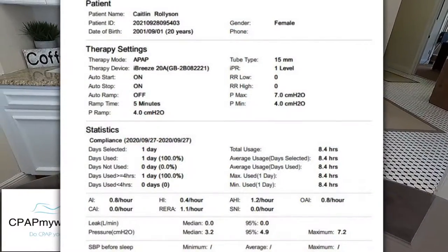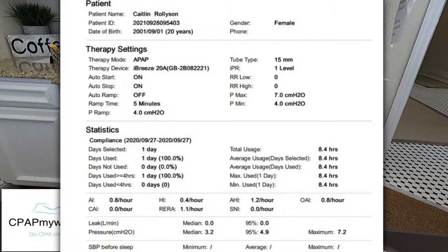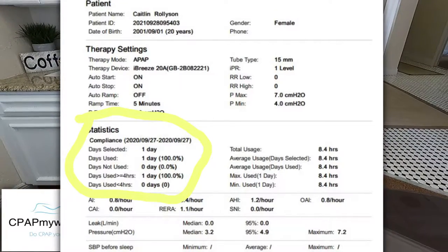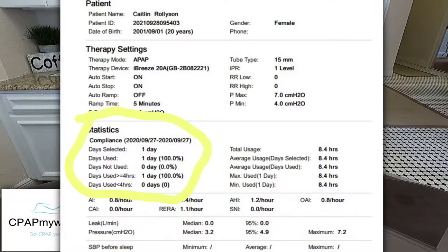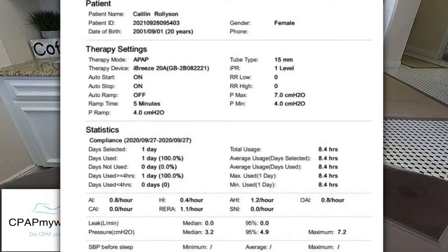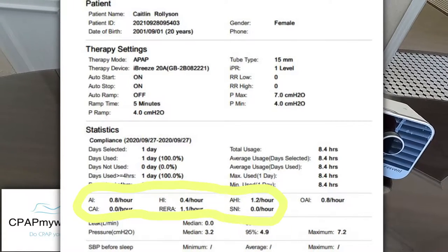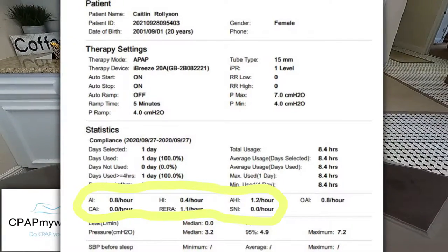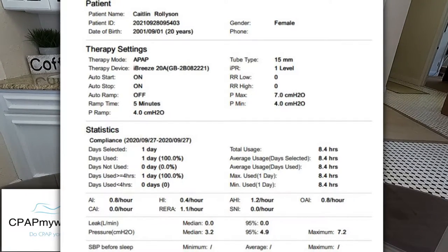And then we did go ahead and print out her compliance report for one night so that you can see exactly what that looks like. I'll pop it up on the screen. It does produce a great compliance report for therapy. You'll see that when you're selecting the time frame, we've just got one day. But if you needed a 30-day report, you could select 30 days, and it would give you your percentage over 4 hours for 30 days, which would be your compliant percentage. It also tells you about your usage, your 95th percentile pressure, your apnea-hypopnea index, and whether you had any central apnea. It also has some other information that is only relevant if you're using it in conjunction with an oximetry device or something of that nature. So it produces a great compliance report as well.